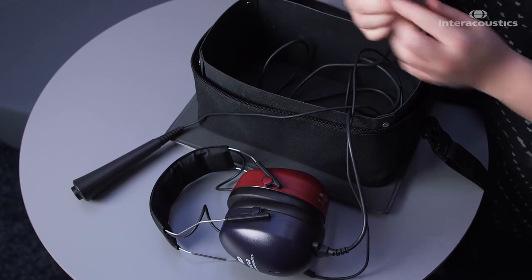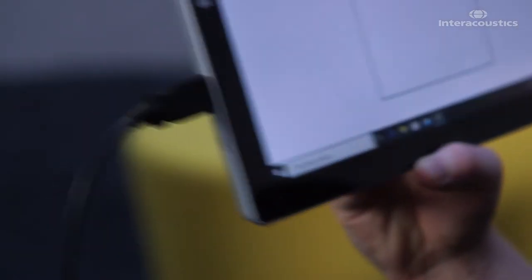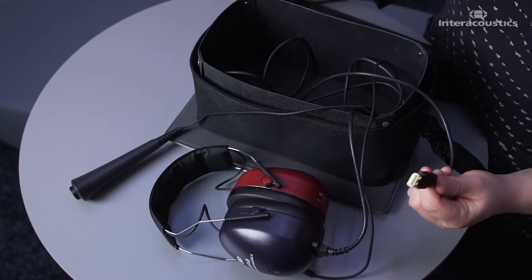It also includes a USB that is used for plugging it in to a tablet or a PC. And that is simply the LUNA audiometer headset.